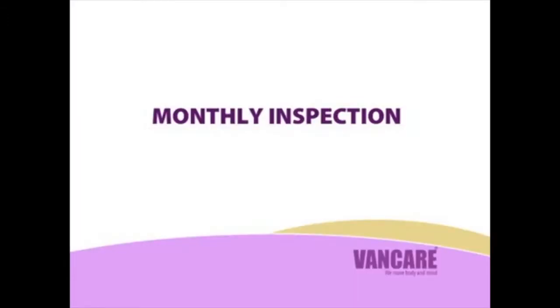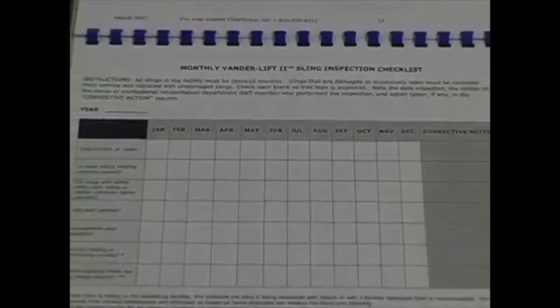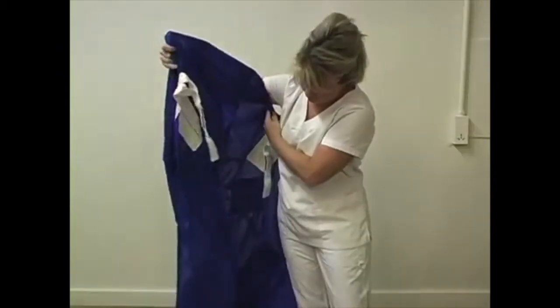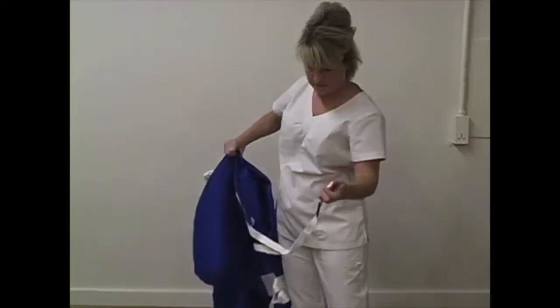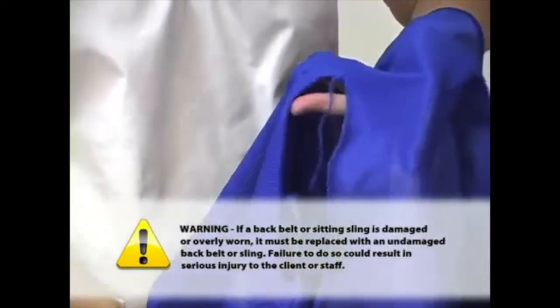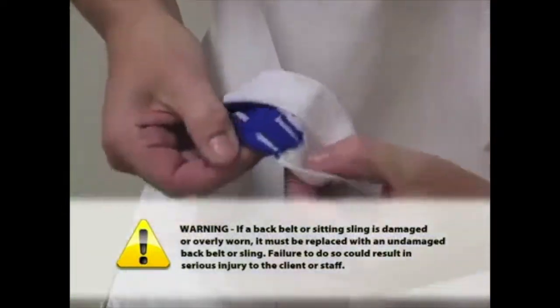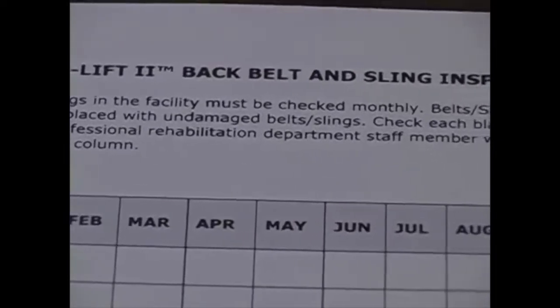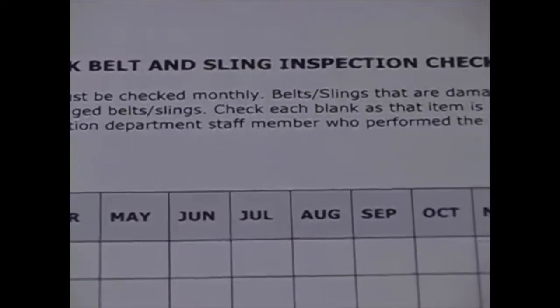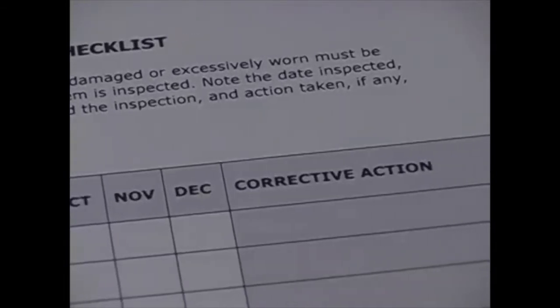Monthly inspection. Monthly inspections of back belt and sitting sling: A nurse or professional rehabilitation staff member is required to inspect all Vera 2 back belts and sitting slings for signs of damage, loose and missing stitching, and tears and excessive wear that might cause them to fail, at least monthly. If a back belt or sitting sling is damaged or overly worn, it must be replaced with an undamaged back belt or sling. Failure to do so could result in serious injury to the client or staff. A permanent record of each of these inspections and action taken should be kept by the facility. See the monthly Vera Lift back belt and sling inspection checklist at the back of the Vera 2 operation manual or contact your distributor for a copy.